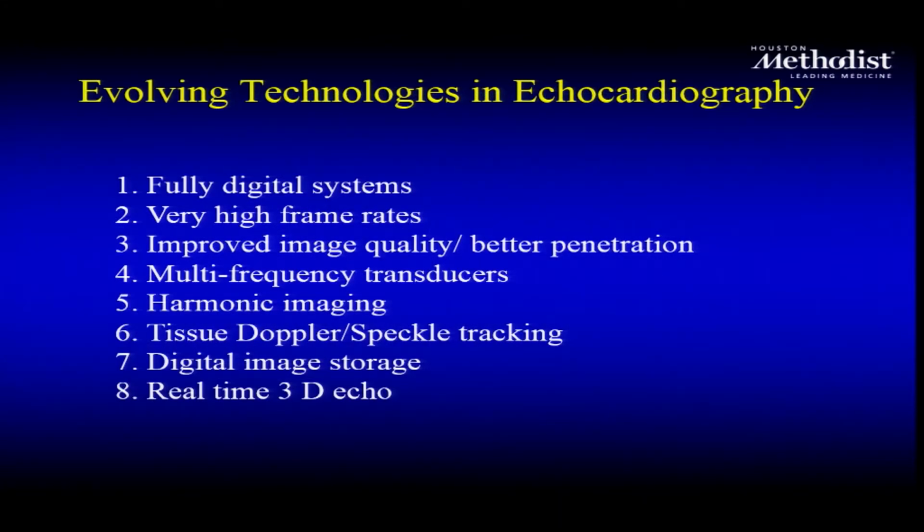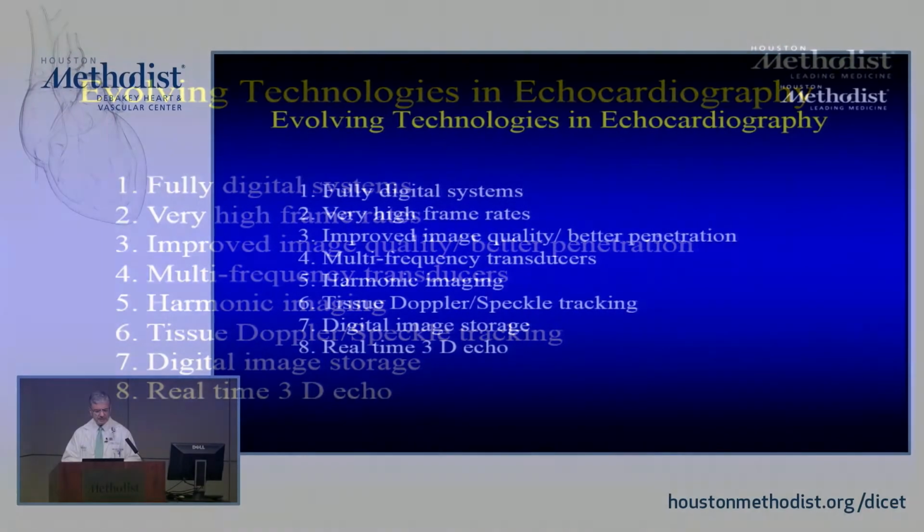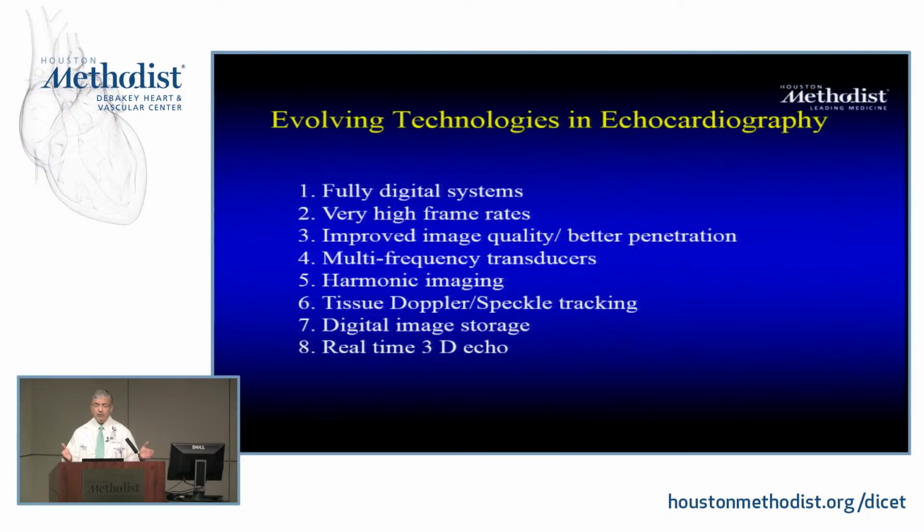And technologies have evolved. It's really amazing. I mean, in the history of medicine and history of mankind, this technology has not been there for too long. And if we have time, I'll show you the first ultrasound that was done by Dr. Edler himself. But we're talking about 1950s. And an incredible improvement in everything else that we use based on the same principle. The principle is I use ultrasound, reflect it, and then analyze it whichever way.